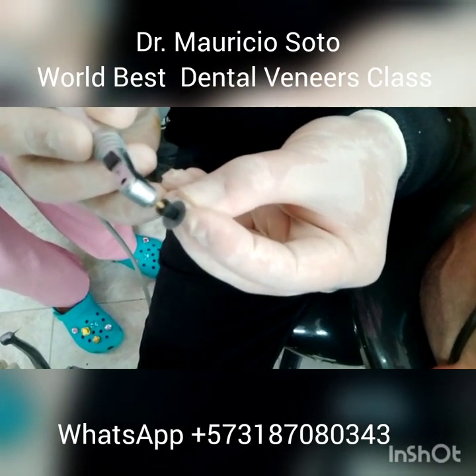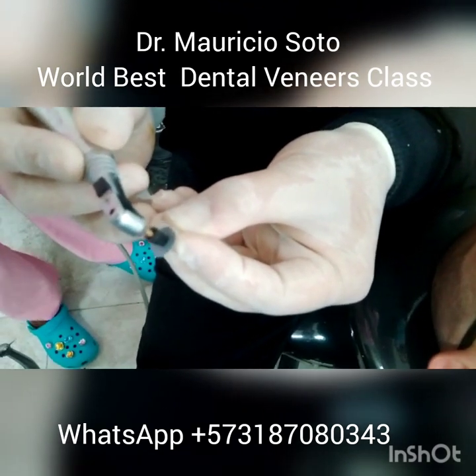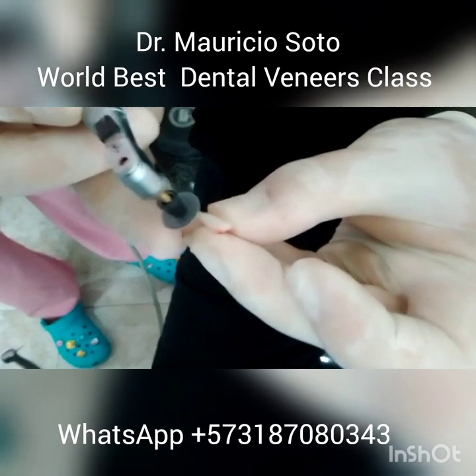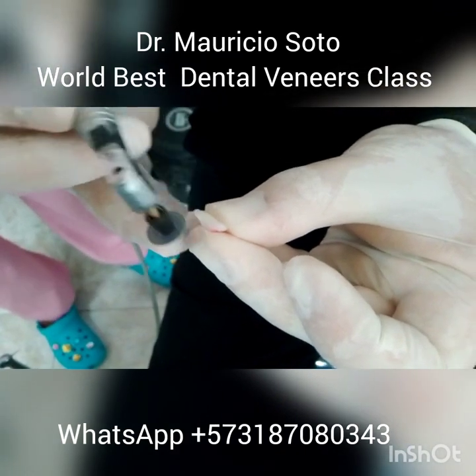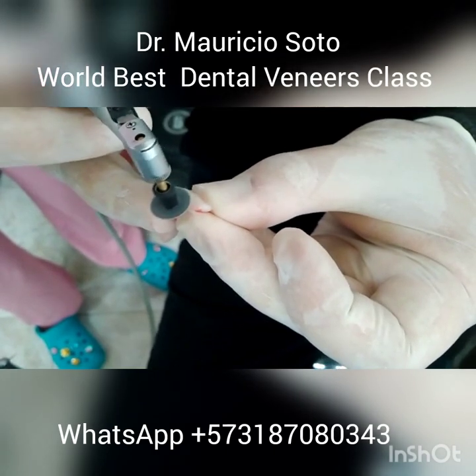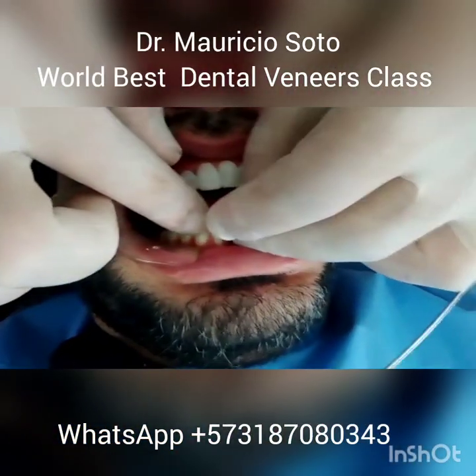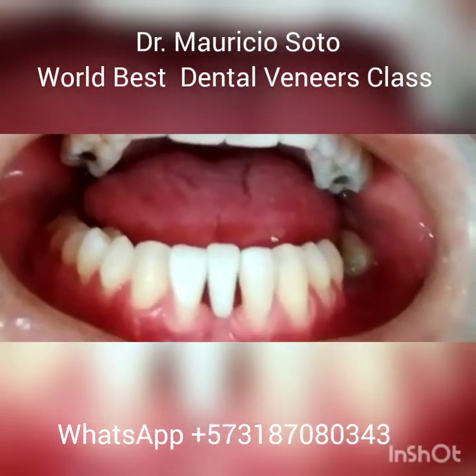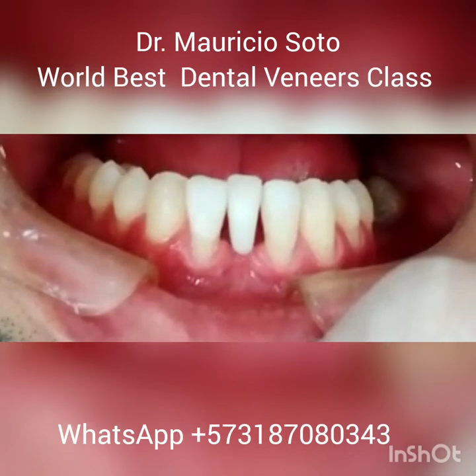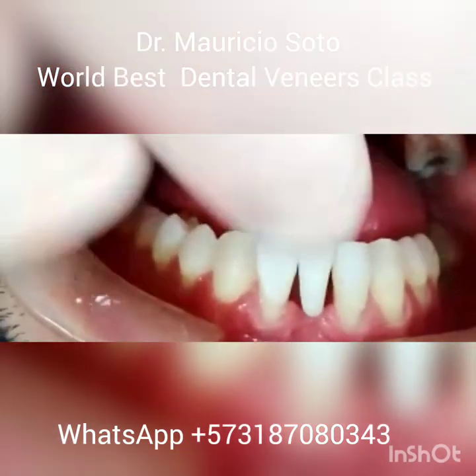After choosing the tooth that you want to use, you need to adjust the size so that it fits perfectly in the space. For this you can use a black disc. Now you prove and check that it fits well before starting to do the bridge — check that it fits exactly.